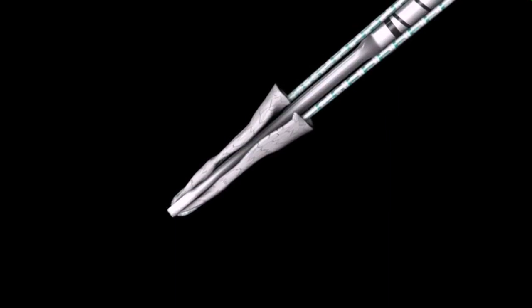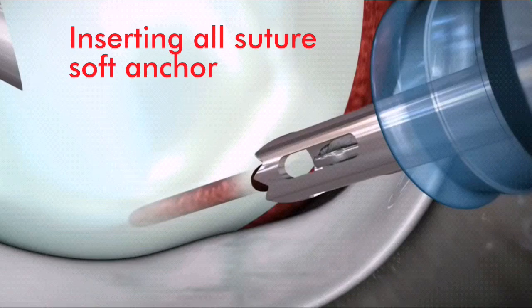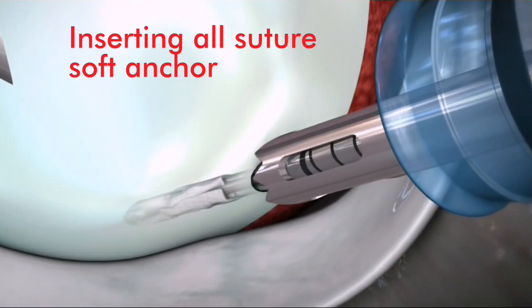Insert the Y-knot through the drill guide. Use a mallet to advance the Y-knot until the proximal laser mark is flush with the proximal end of the drill guide.